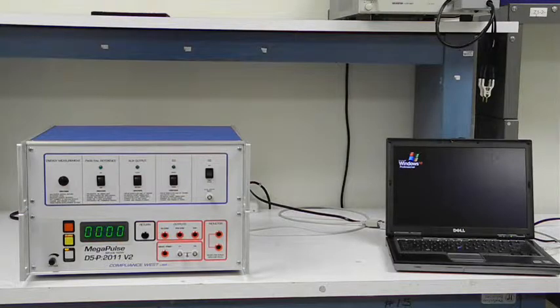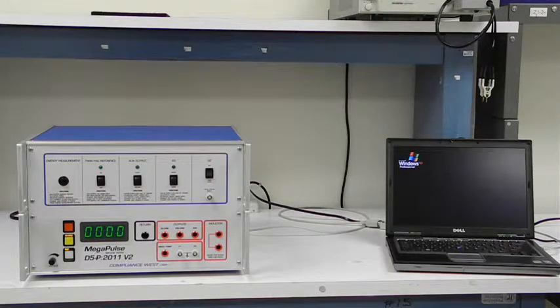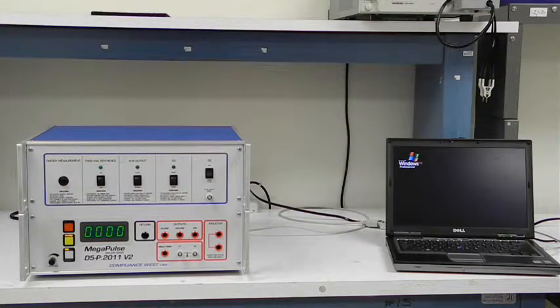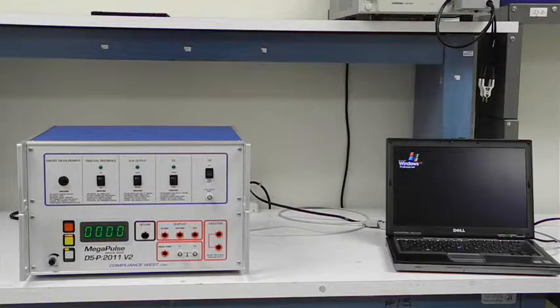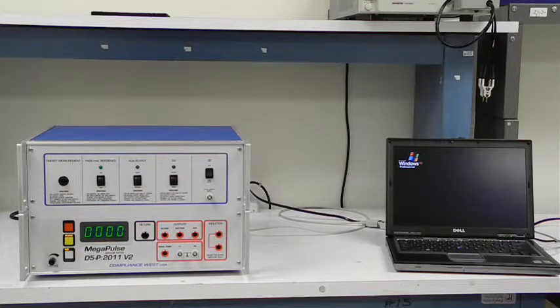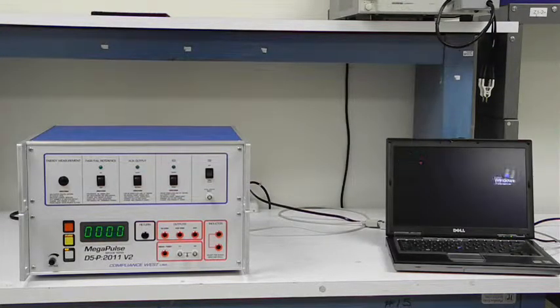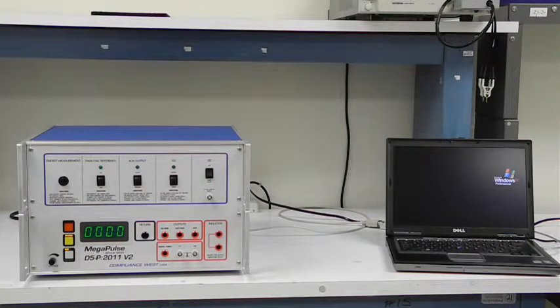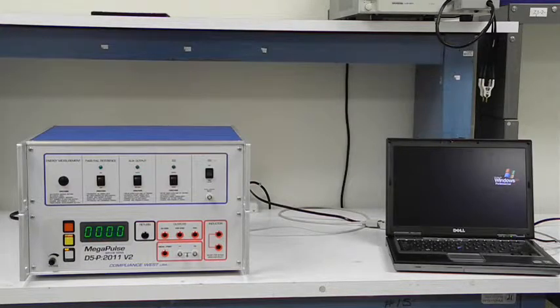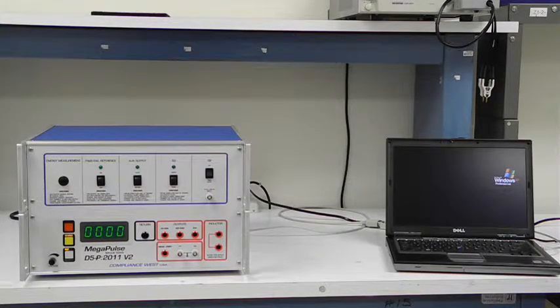The test is conducted by connecting each patient connection or applied part in turn to the output of the defibrillation test equipment, with all other patient connections and applied parts connected to ground.